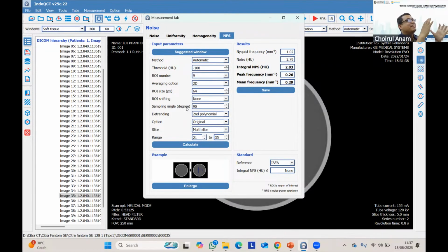But if we do a specific study, we can isolate the noise, for example, only from the system limitation. But we need many data to isolate only one source. If we measure in 1 ROI, we actually capture the total noise from all sources.